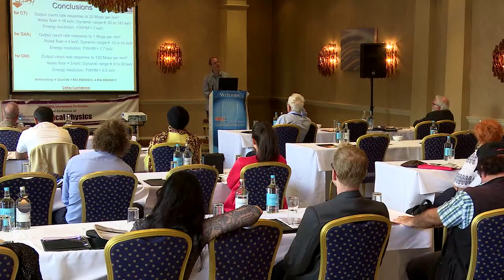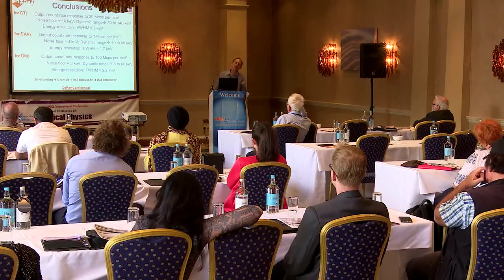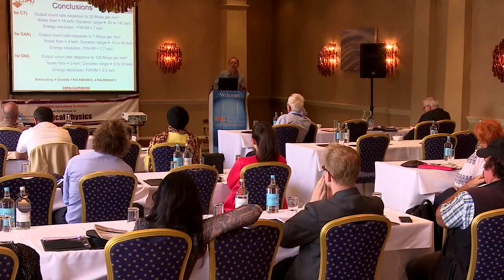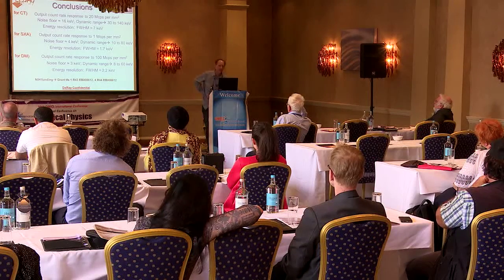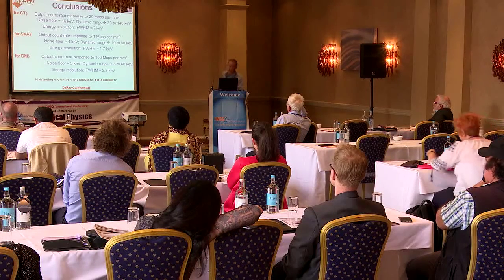Okay, so in conclusion, we have achieved an output count rate of 20 million counts per square millimeter for CT with a noise floor of 16 keV and a dynamic range between 30 and 140 keV. So you see that that covers the dynamic range for CT, and an energy resolution of 7 keV.